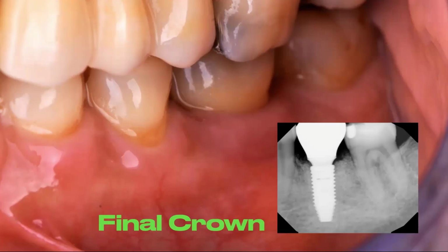Our teeth are that way, right? We have the middle of the tooth, and then we have the crown. Well, it should be no different for a dental implant. So cone beam CT scanning and utilizing that in your office every day will really allow you to provide this type of therapy on a routine basis. And that's pretty awesome because that's what we want, right? We want to provide repeatability, predictability, but also provide care that's going to be really, really stable.